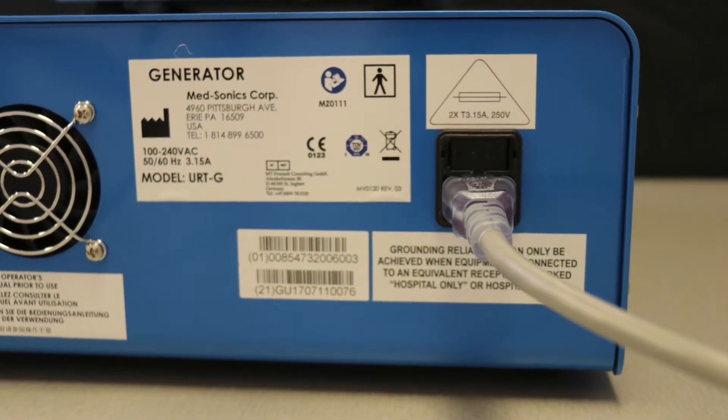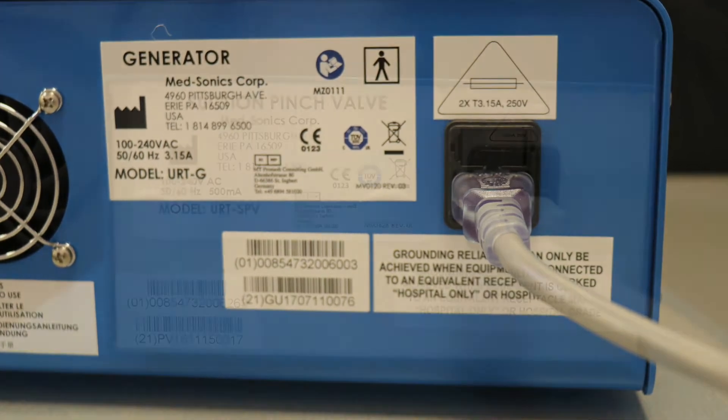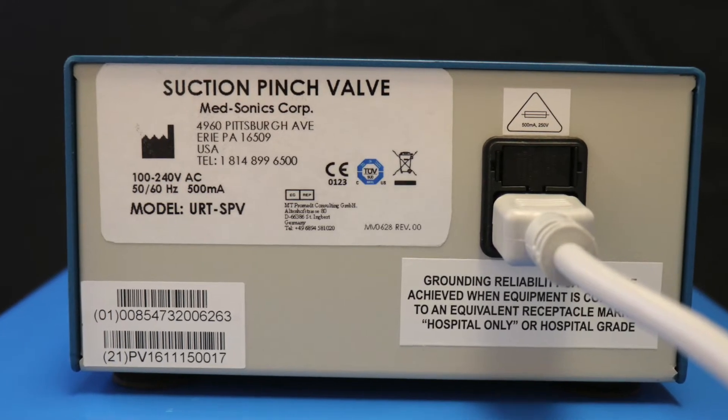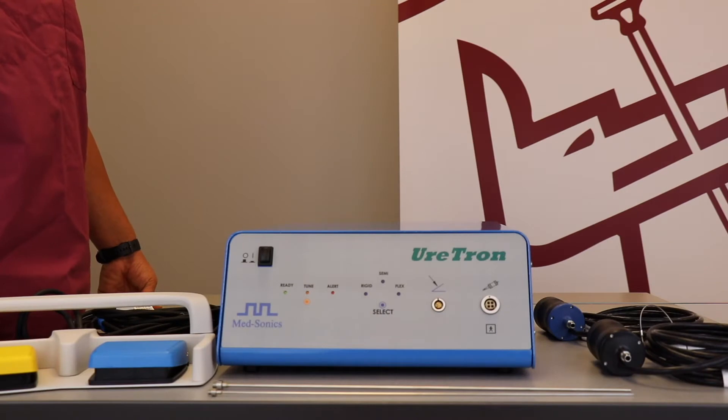The generator's power input is located on the right side of the back of the unit. The suction pinch valve's power input is also located on the right side of the back of the unit. The most important thing to remember when setting up the Uratron system is to make sure that the generator is off before plugging in any of the components.